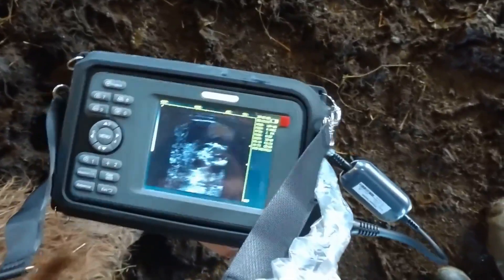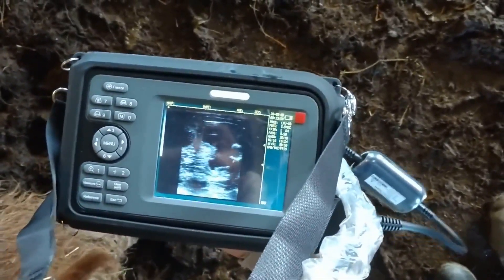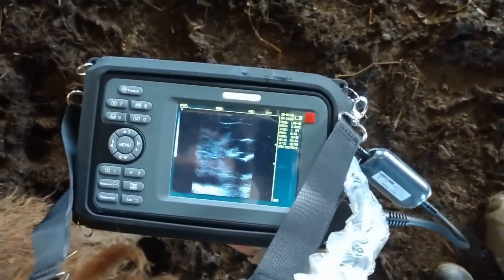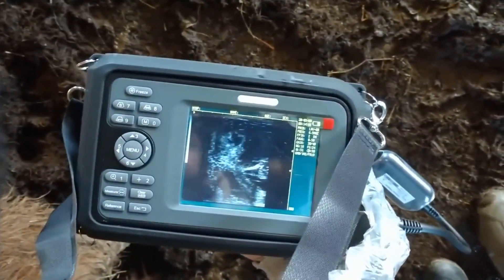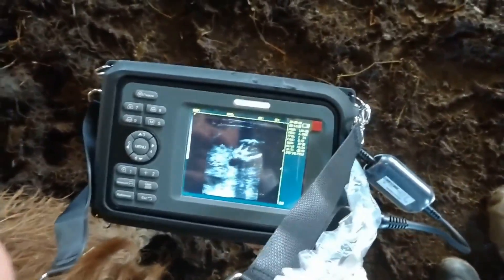Right there, that thing in the middle of the screen — that's the baby calf. Looks like a little alien! Quite a piece of technology for us.